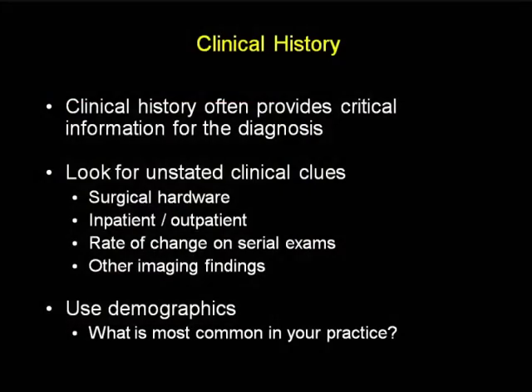As you all know, clinical history often provides the critical information for diagnosis, and if we're lucky, our clinicians will give that to us. But very frequently they don't, and when that happens, you have to be smart. You have to look for unstated clinical clues that are present on the imaging exam or acquired some other way. So look for surgical hardware.